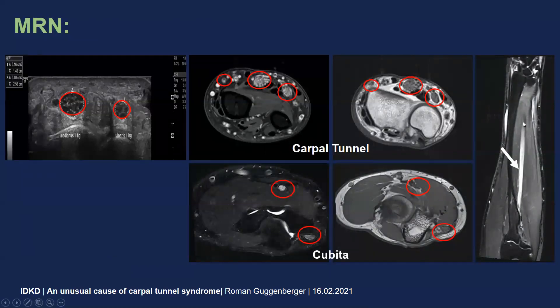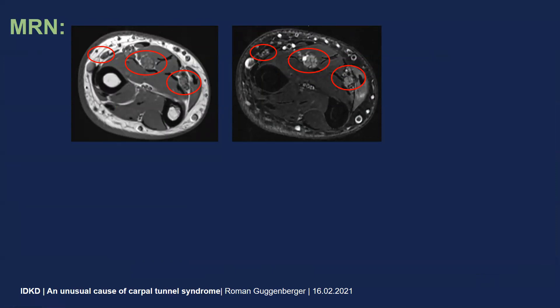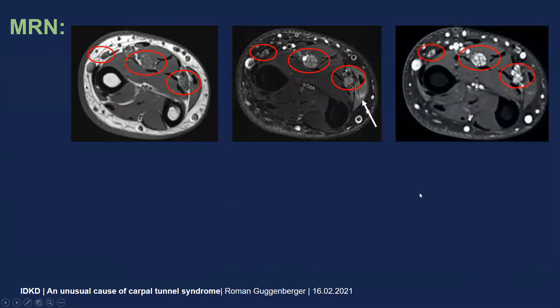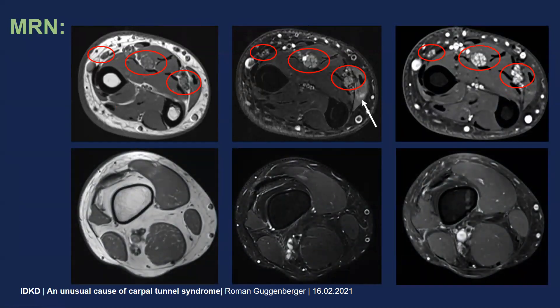Also on a coronal T2 fat-sat, we could see those long-segment enlarged nerves with increased signal intensity. The same findings we could see at the cubital level with an enlarged median nerve and enlarged ulnar nerve, increased in signal intensity on T2 fat-sat, and again the perineural fat planes were preserved on T1 weighted images. In addition to pathologic nerve changes, we would also find edematous changes of some muscles, like in this case the flexor carpi ulnaris muscle with edematous change of the muscle belly at the myotendinous junction. After IV contrast, we would find significant contrast uptake of all the nerves that were also increased on T2 fat-sat images. The symptoms did not only present at the forearm but the patient also experienced problems in his lower leg, which is why we also performed MR neurography of the lower leg, and we would also find fascicular patterns with increased signal intensity and contrast uptake of the common peroneal nerve in the poplitea.